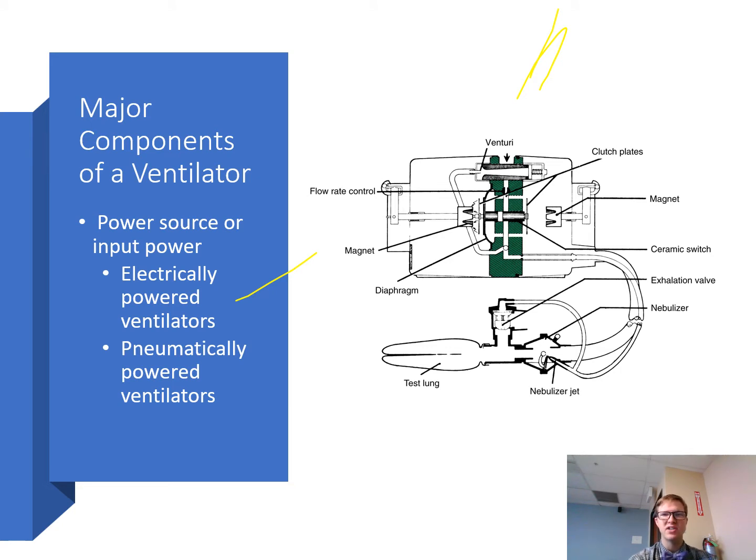They are only occasionally used to provide ventilation to patients in an acute care setting, so they weren't for long term. Very few of those are used today, right?